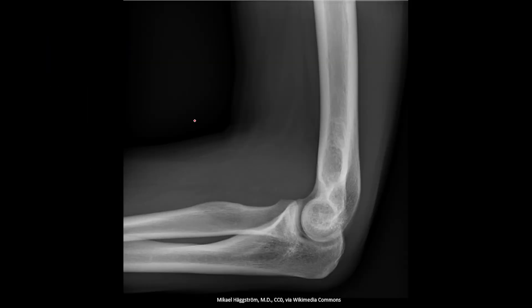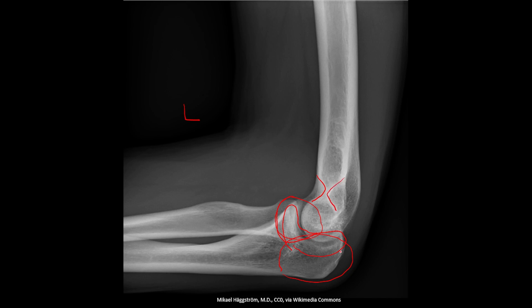On the lateral x-ray of the elbow, we can see the trochlear notch better, and also the olecranon better. The articulation between the radial head and the capitellum is also more visible, and on the lateral view you can also see the coronoid fossa and the olecranon fossa.